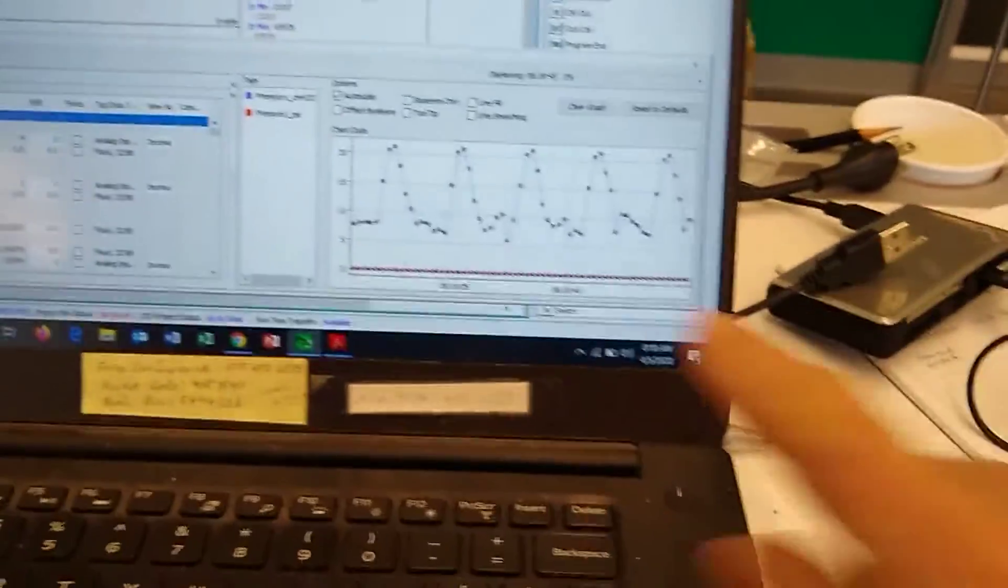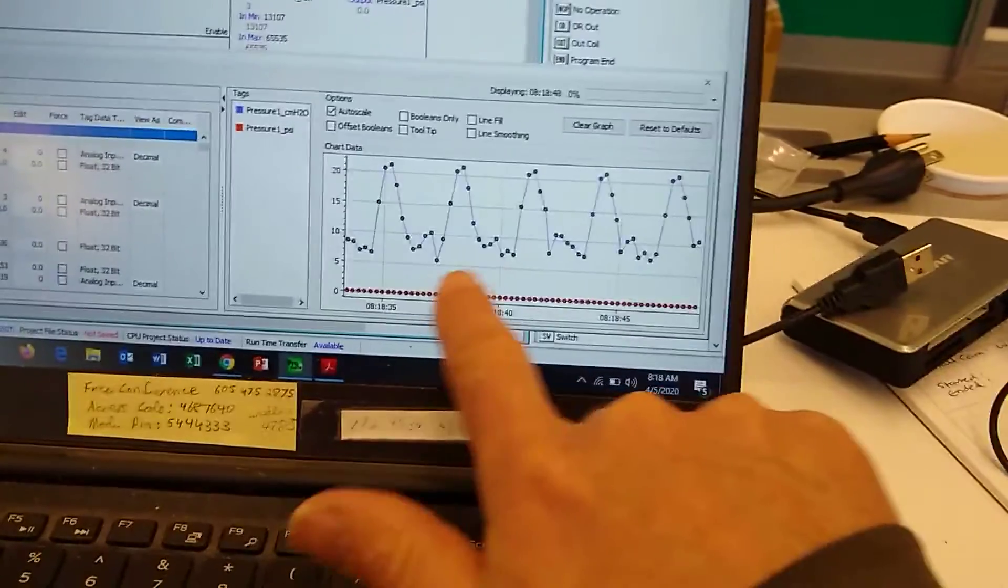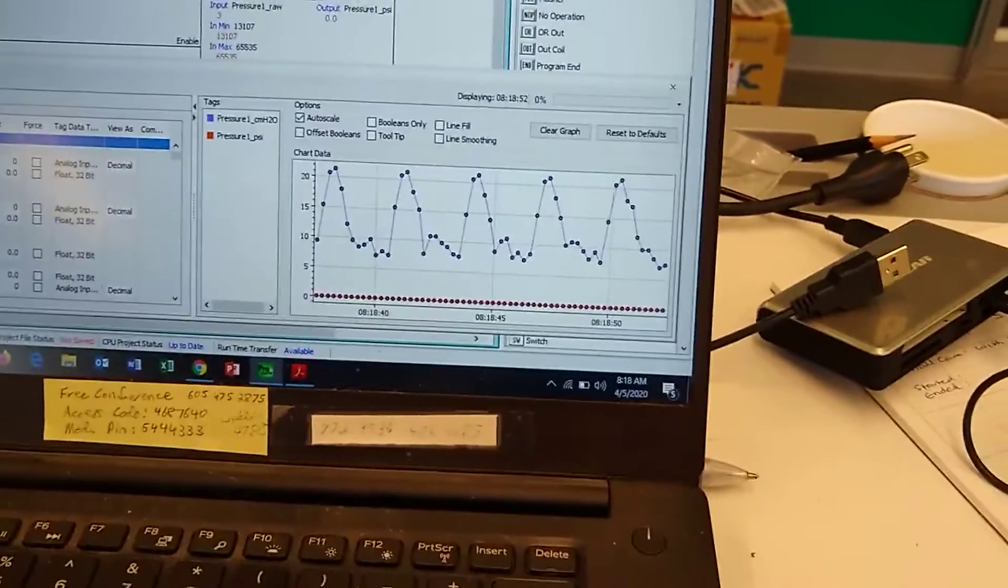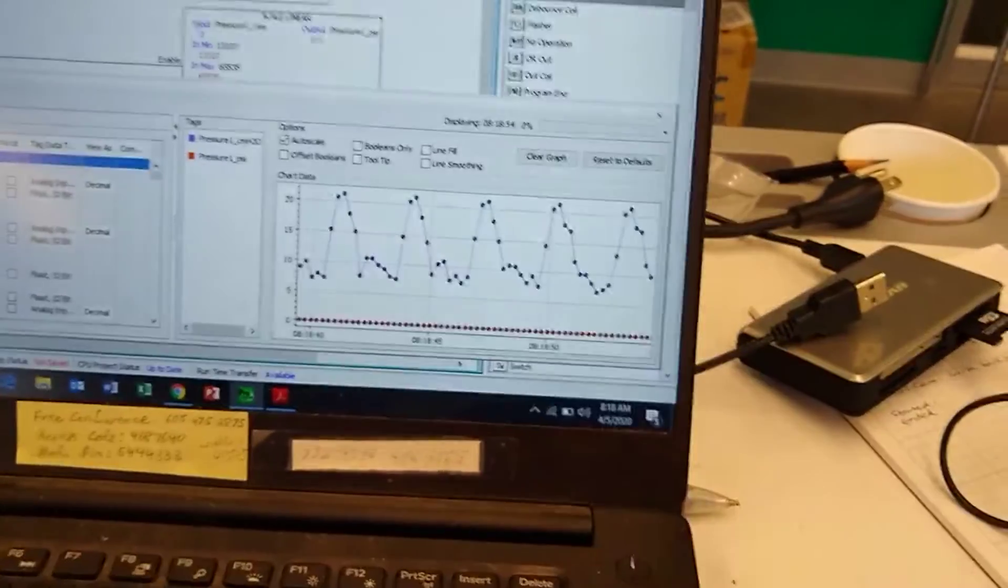Over here, we are measuring our pressure in centimeters of H2O. We can see our min pressure is at about 7, and our max pressure is a little over 20.